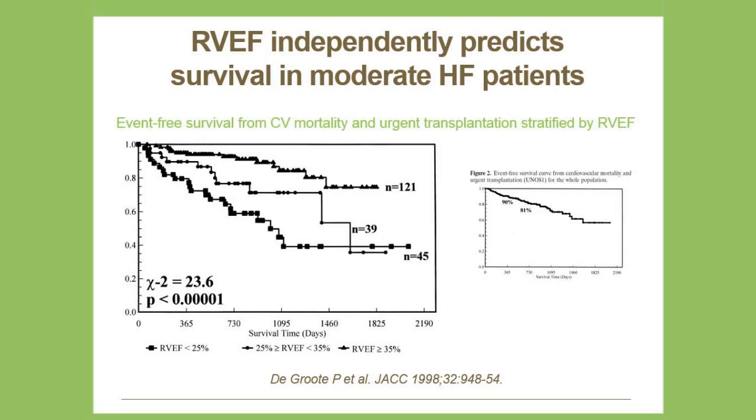on stable medications. Note that in 1998, included in the study, there were only 17% of the patients who were on beta blockers. So they recruited 205 patients, and they did exactly the same study design: symptom-limited cardiopulmonary exercise stress test, rest and stress first-pass radionuclide ventriculography, and here is the profile of these patients.